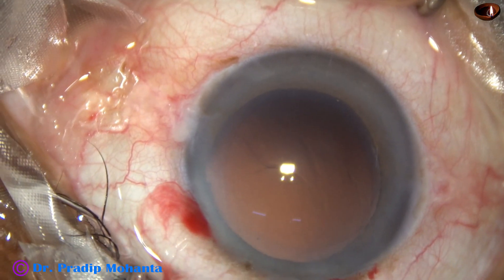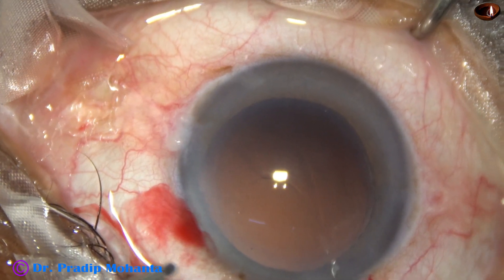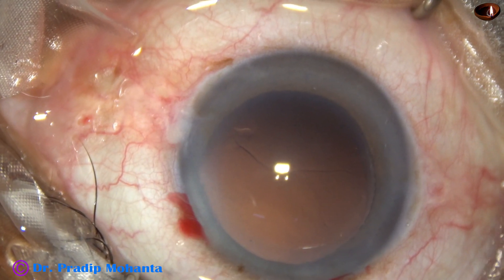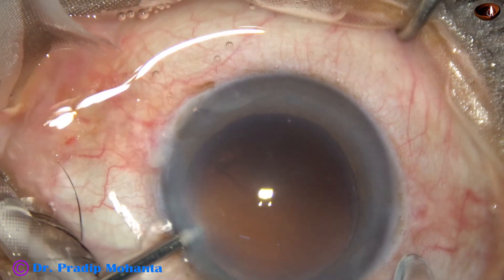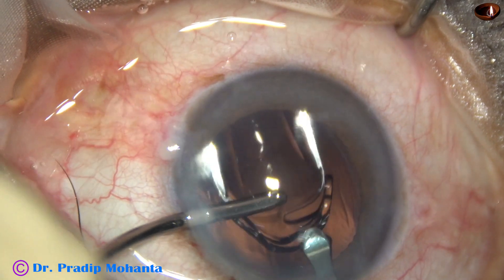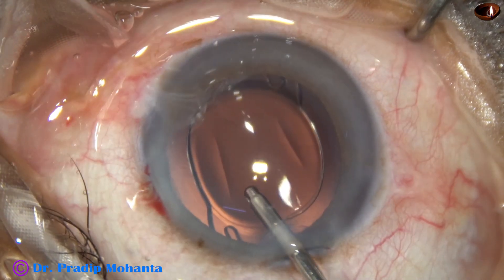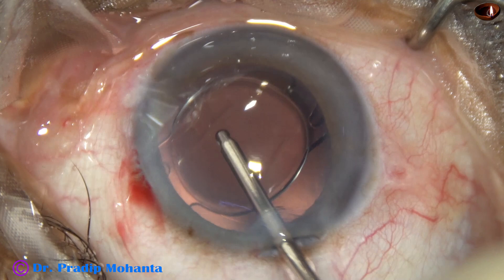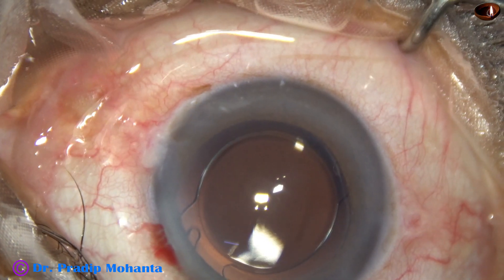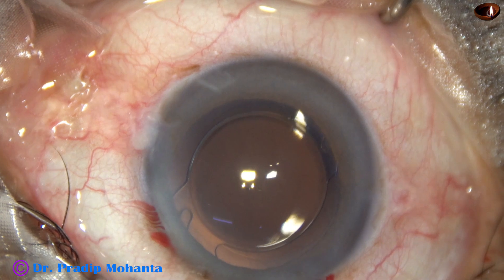Now is the time to implant an intraocular lens. The main wound is being enlarged a little bit because I am going to use a B-cartridge wide-bore cartridge. The size of the main wound is about 3 millimeters now. Here goes the intraocular lens. The haptics are in the capsular bag. The rhexis is so large that the anterior capsular rim does not overlap the optic — the rhexis size is about 6.25 millimeters.